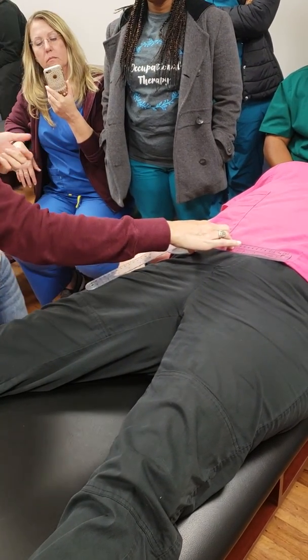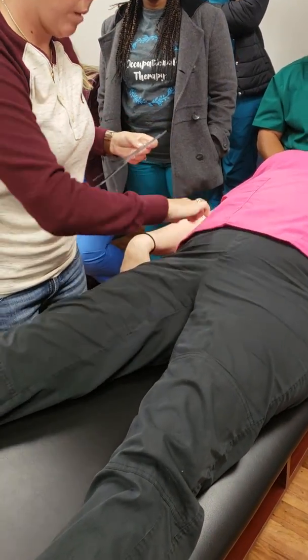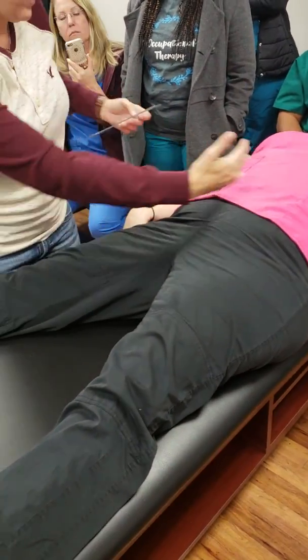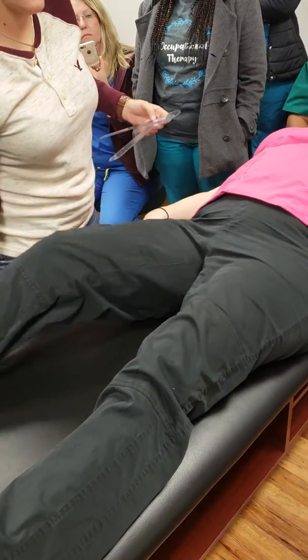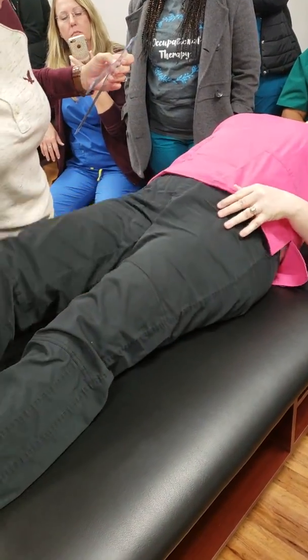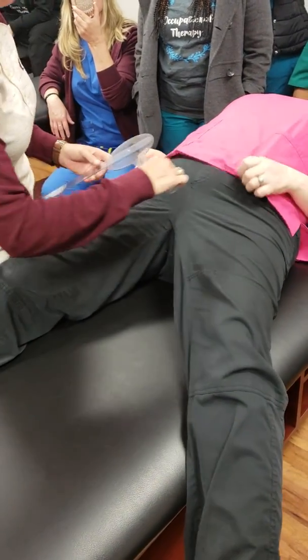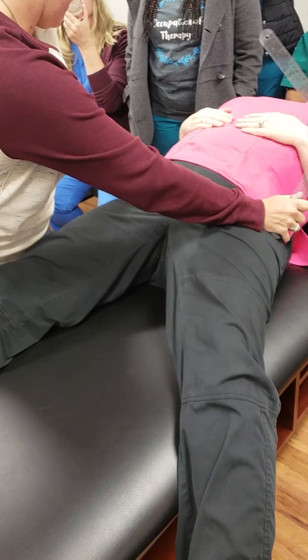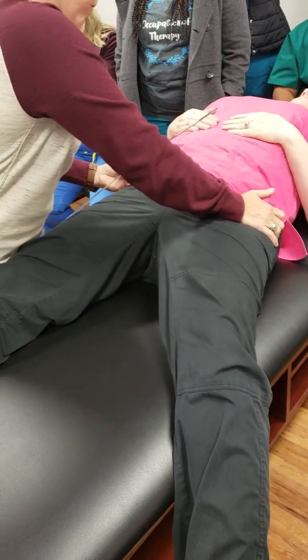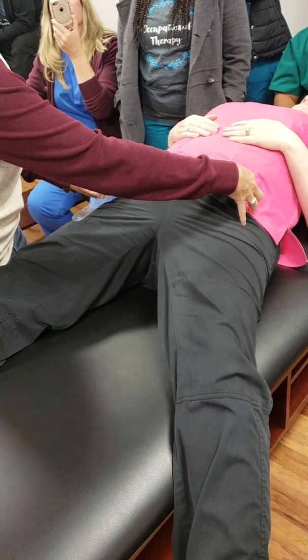Okay? Now for adduction, it's the same thing, same landmarks exactly, but now you're going to scoot towards me, because we're going to measure the right side. What you do with the opposite leg is move it out of the way. Now they can adduct, so we can bring the other leg in. So again, ASIS, there. Now again, we're starting at 90, which is our 0.